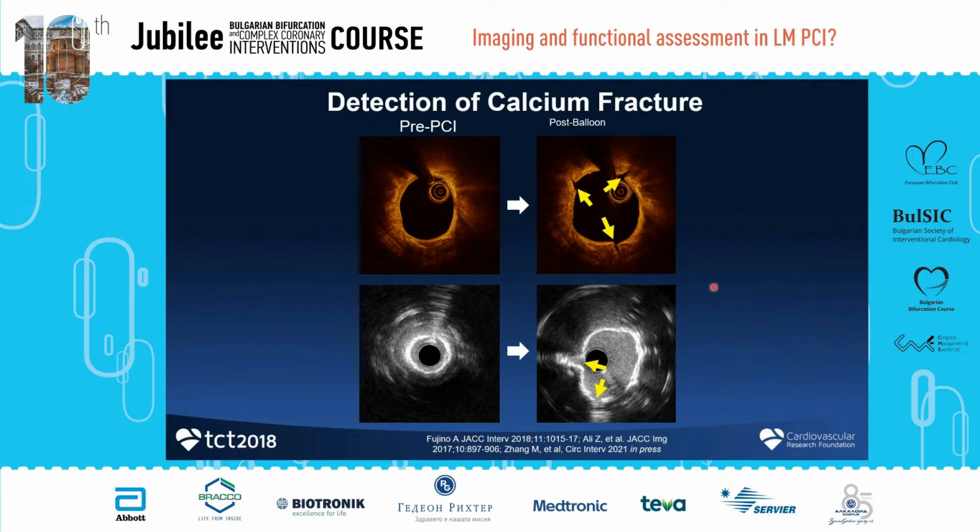And what is quite important is confirming the calcium fracture before stenting. This is an OCT picture; you see the nice calcium fracture. This is the IVUS; you see the nice calcium fracture. Confirming those is really important to secure good stent expansion.